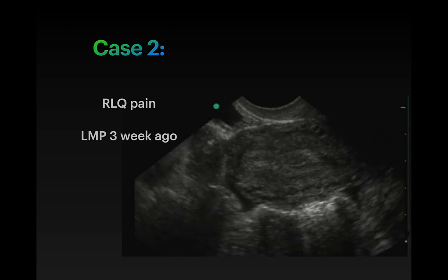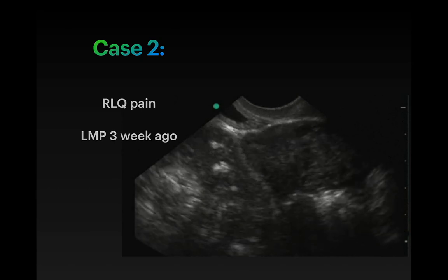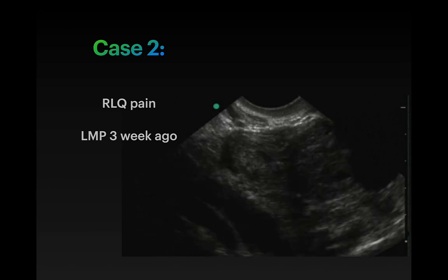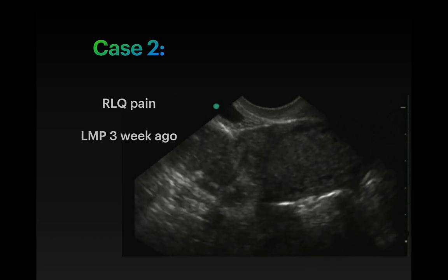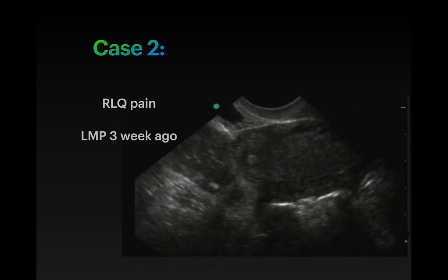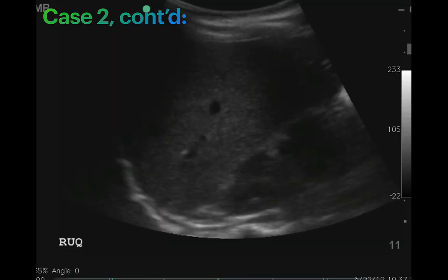And so it's really easy to transition. You guys have already done a couple of these ultrasounds. It's really easy to lose track of what's uterus and what's the tissue right next to it. And so it's really easy to slide into this ectopic pregnancy and not notice that you have slid out of the uterus. So when you find it, do a double take and be like, okay, I know where I am, what's around me as well, and make sure that that myometrium is nice and thick around it, and you're actually in the uterus, instead of over here, where the uterus is going, hello.